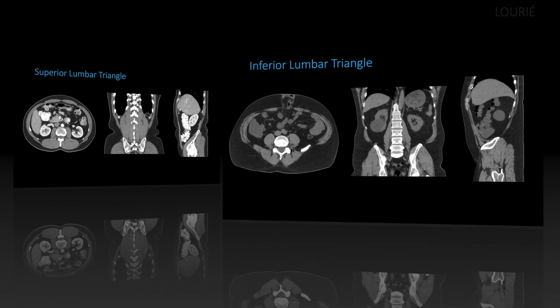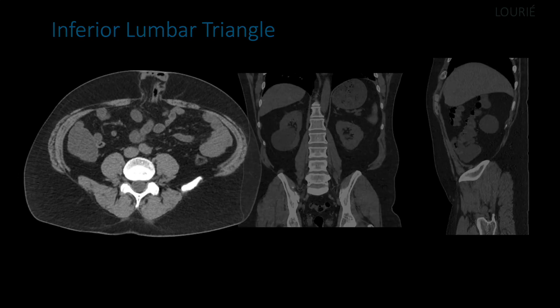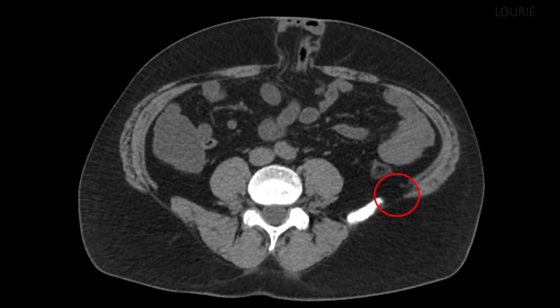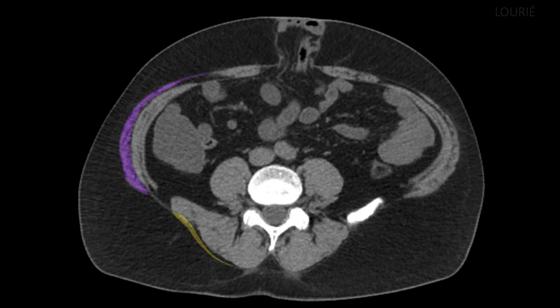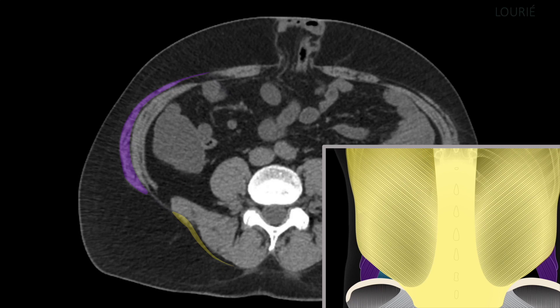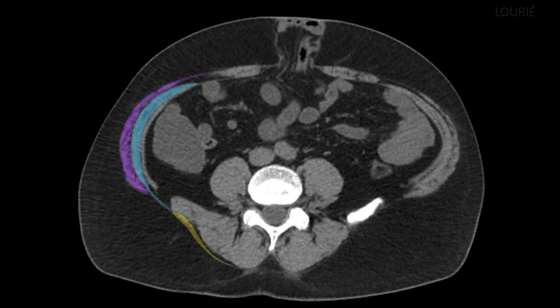Now let's look at normal CT anatomy of the inferior lumbar triangle. In the axial view, this patient has a large incisional ventral hernia, but let's focus on the iliac crest. We see a gap and a weak spot on both sides. On the patient's right side, the gap is between the superficial external oblique in purple and the latissimus dorsi in yellow as they approach the iliac crest. The floor of Petit's triangle is formed by the blue internal oblique, which is quite thin as it fuses with the medial thoracolumbar fascia. The quadratus lumborum in red also forms the medial internal border of Petit's triangle.